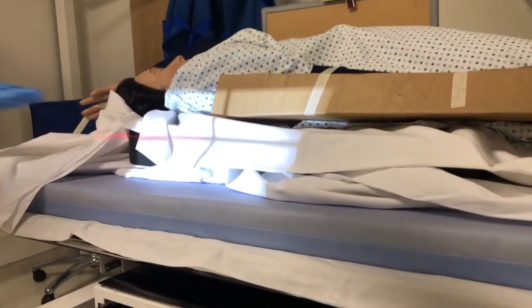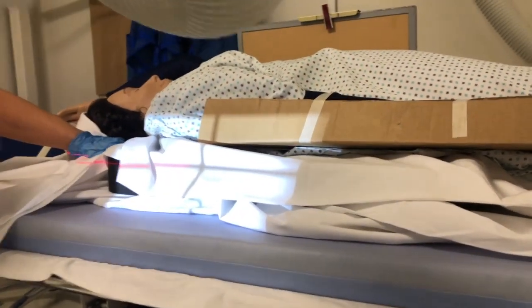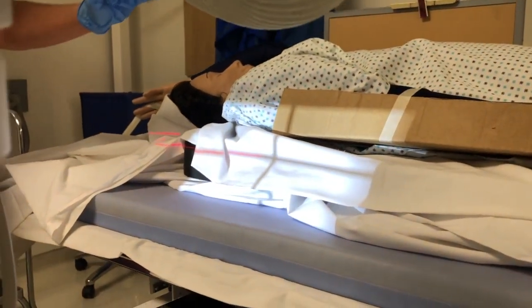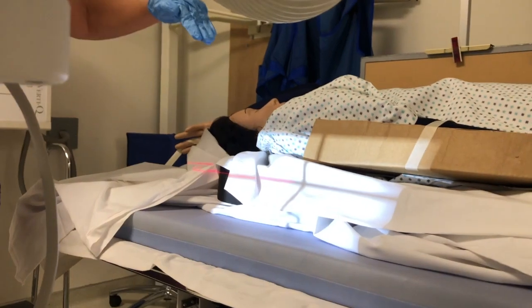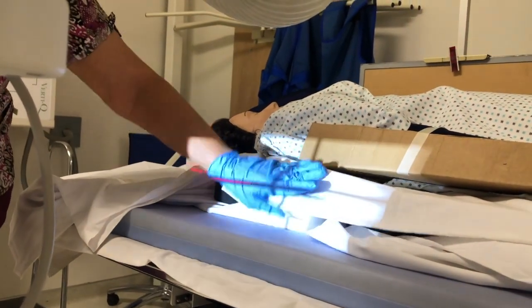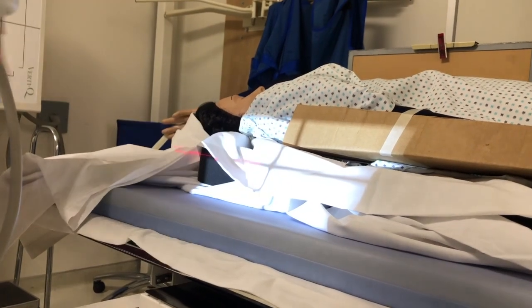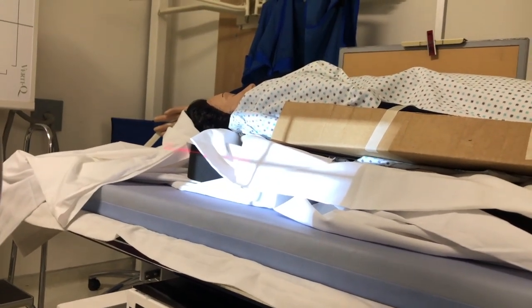and I can tell here that I'm below her C-spine, which makes sense because the C-spine has a lordotic curve, thoracic spine has a kyphotic curve, so it's just off the bed. So I'm going to be pretty posterior here.